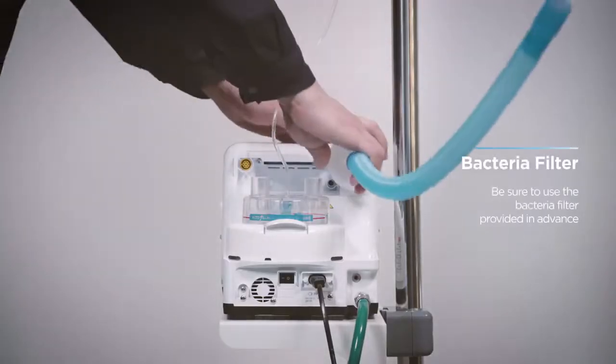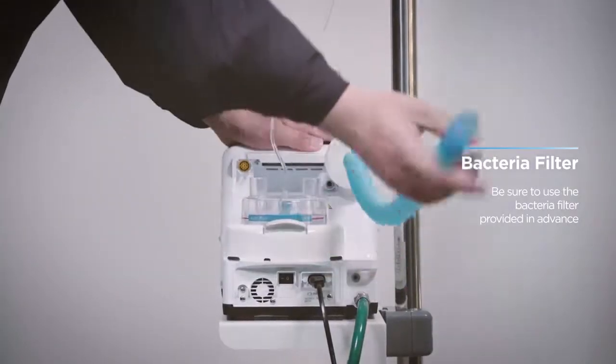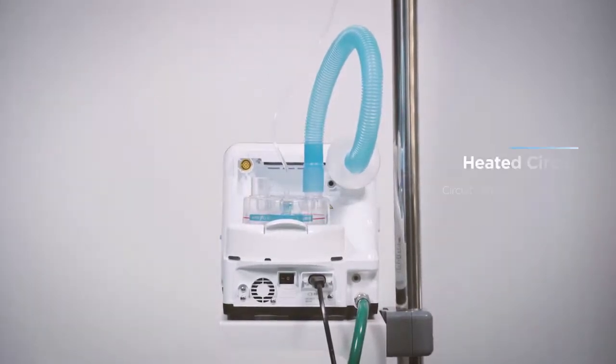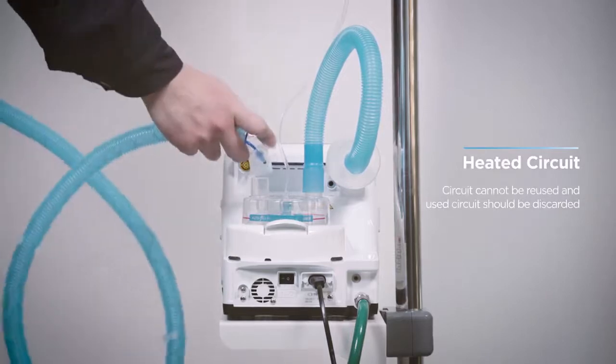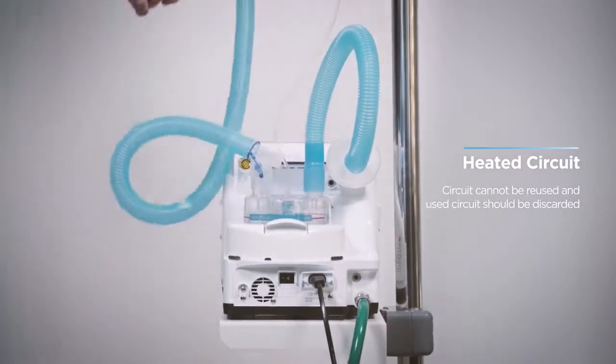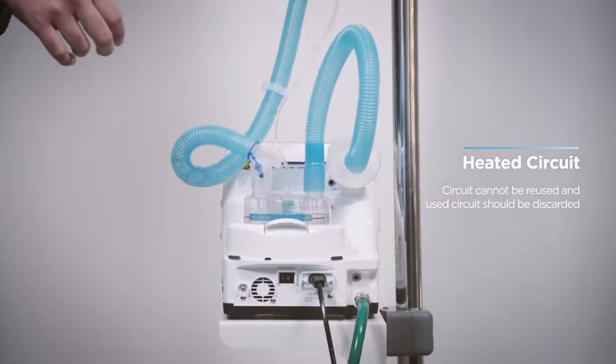Connect the bacteria filter to the gas outlet port and connect the other side to the water chamber. Connect the heated circuit, which is directly connected to the patient, to the other port of the water chamber. There is a port to connect the heat wire and temperature probe cable in the circuit.